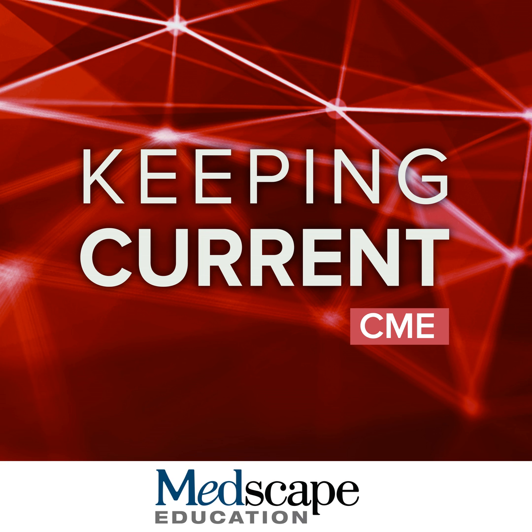So this patient went on to have a coronary angiography, as shown here. Not only did it confirm there's a tight proximal LAD lesion with an acute thrombus that accounted for his symptoms, but there's a second focus of circumflex stenosis that is also accounting for the inferior wall perfusion defect consistent with ischemia. So I think in this case, the CMR illustrates both the qualitative and quantitative aspects of this technology.